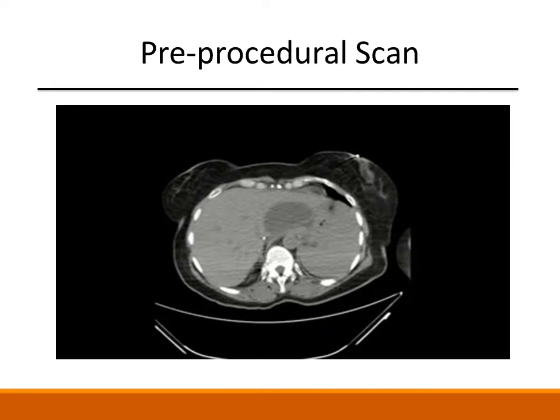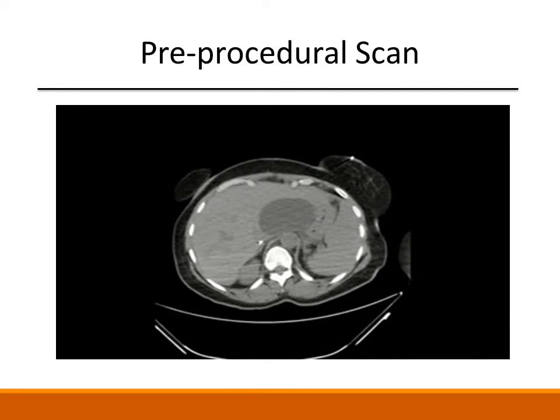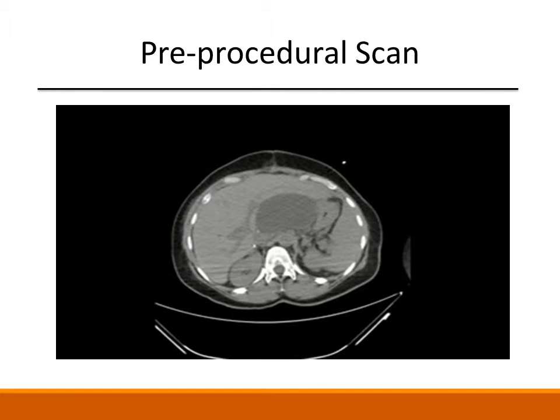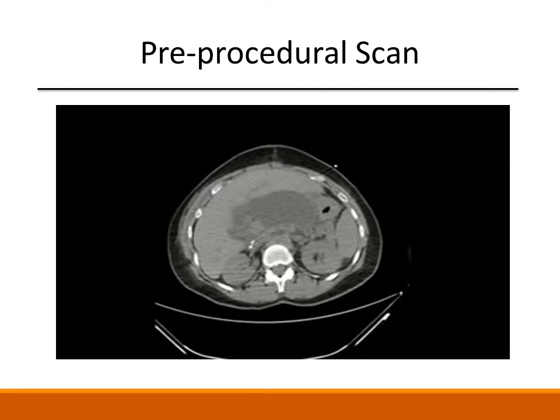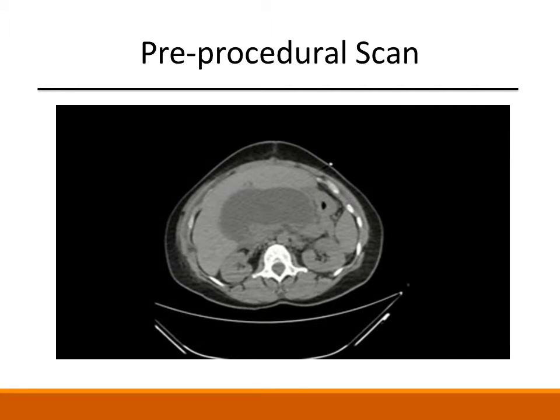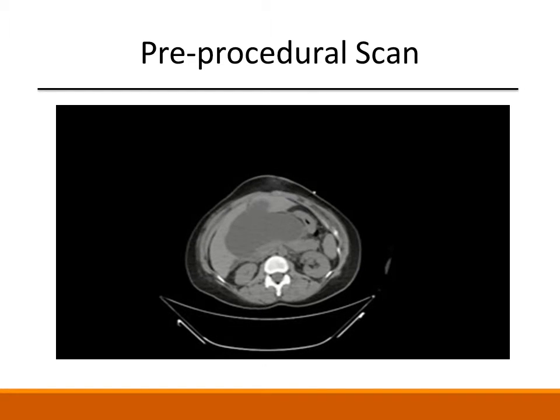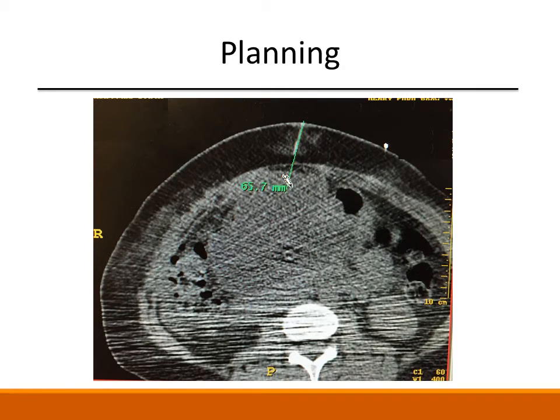Before beginning a procedure, a preliminary CT scan is obtained to visualize the fluid collection. This non-contrast axial CT fluoroscopy of the abdomen shows a loculated fluid collection posterior to the liver. Pre-procedure imaging is also used to determine the safest and easiest path to the fluid collection. The safest path involves the shortest distance to the collection, avoids major blood vessels, organs, or bowel, and is in a straight line from the skin surface. It is important to measure how many centimeters you will have to advance the needle to reach the fluid collection, as well as the appropriate angle of approach. In this case, the distance is measured at 6.6 centimeters.